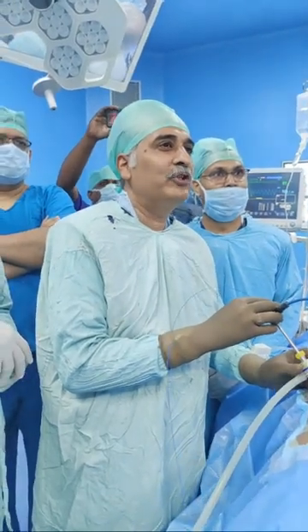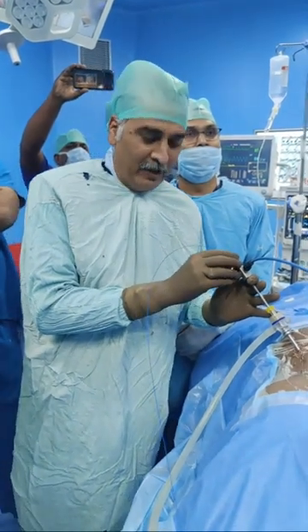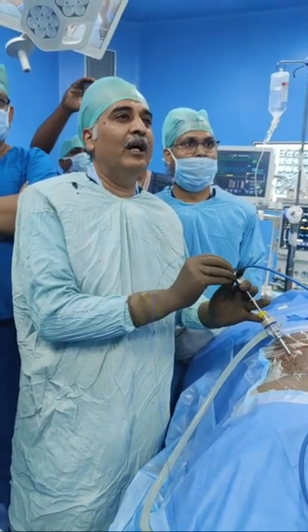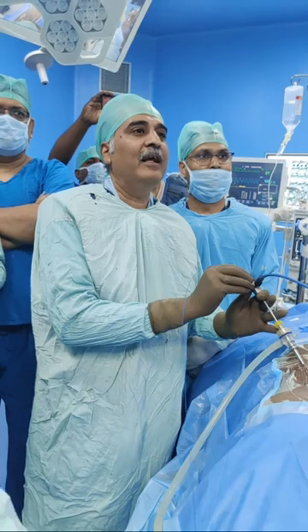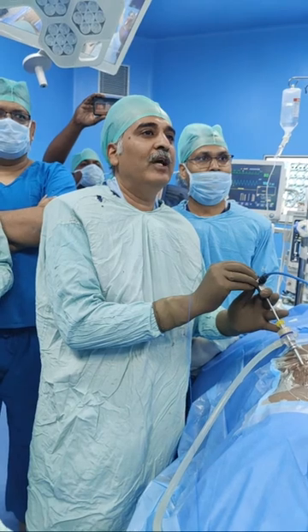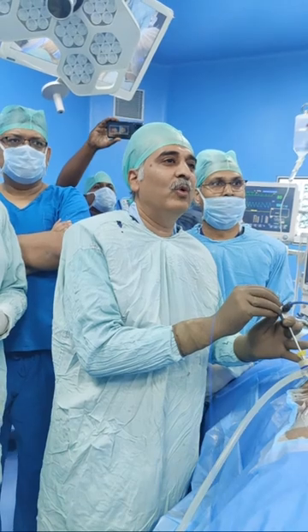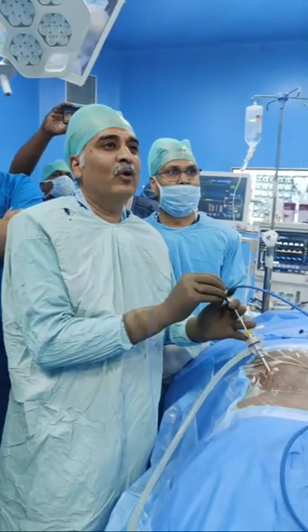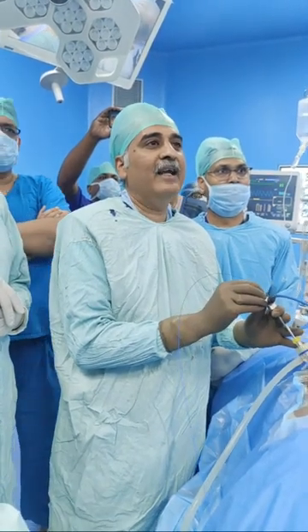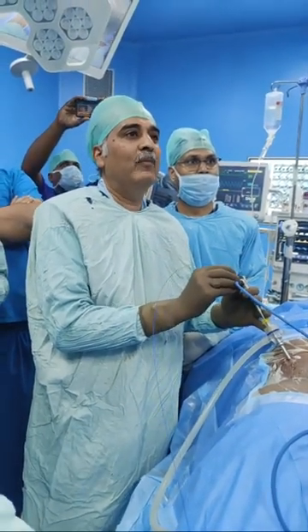I think the future for PCNL would definitely be this. If it's a staghorn stone, we can do it with this 18 and 21 French size mini PCNL, and without removing those fragments, just suctioning them into the bottle would probably be the best way to do a staghorn stone. So I recommend this. I think this is better than the standard PCNL, which we do by pneumatic lithotripsy and then removing those fragments.